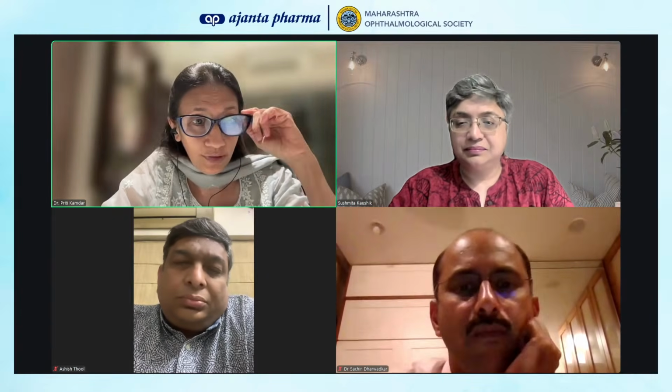So Sachin, any tips on that, Huvitz, or you would say that's the same as what all of us have? You're muted. Knowing the technical nuances, I wouldn't be using any other machine except Spectralis and Cirrus. Yeah, so that is the answer for glaucoma.